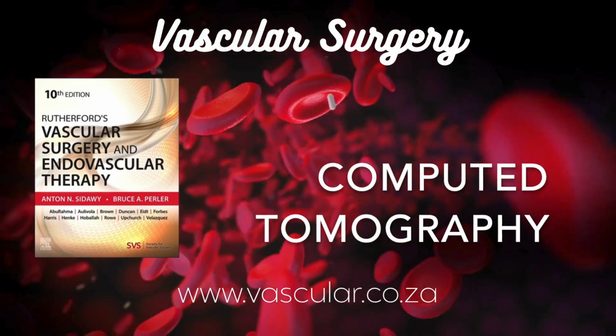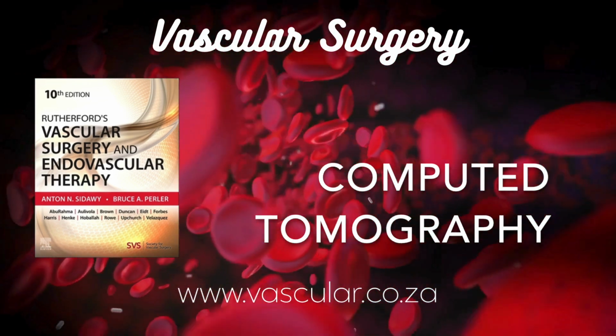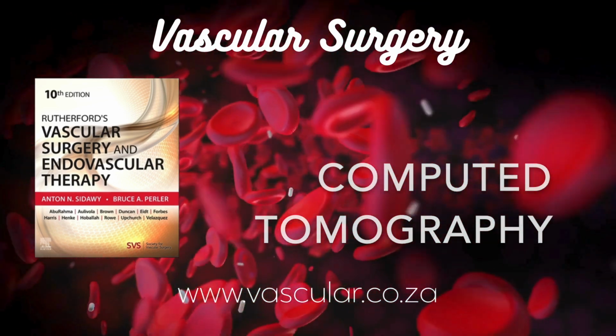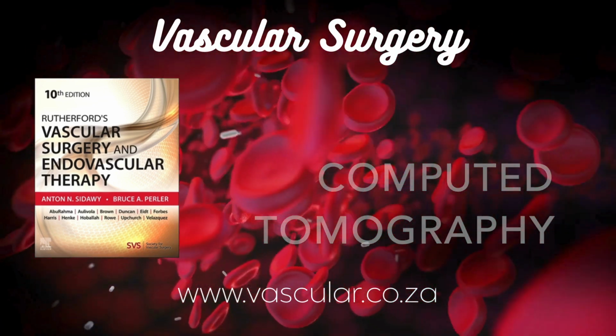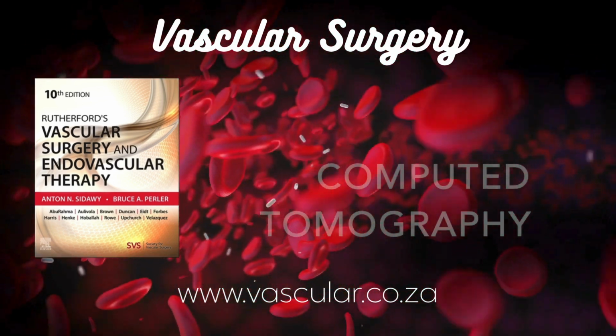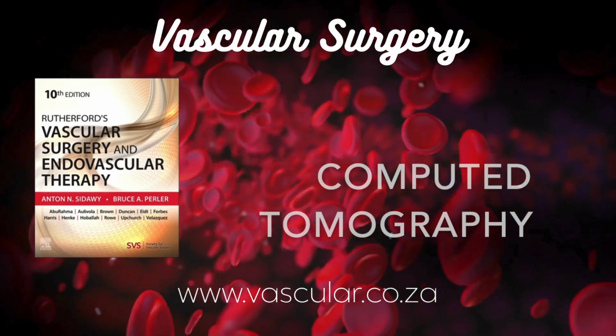How are they made? It leverages the speed of modern scanners, powerful computers, and clever software. The software essentially goes through the 3D voxel dataset and selects voxels based on their HU values. So, like, show me all the voxels with bone density. Exactly. Or, for CTA, show me all the voxels with the high density of contrast-filled blood. But what about calcium in the vessel walls? That's dense too. Does it get included?